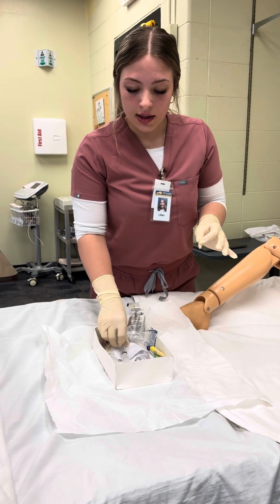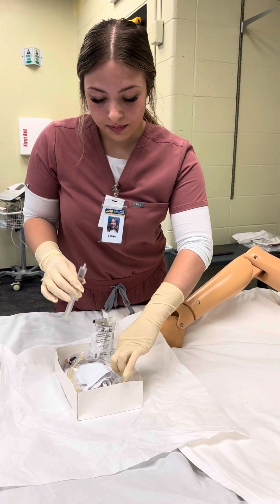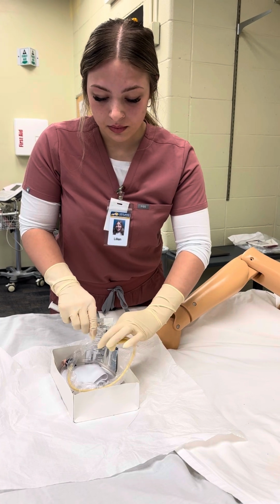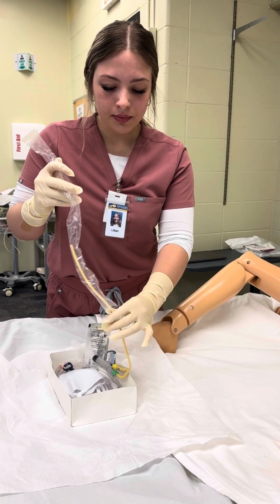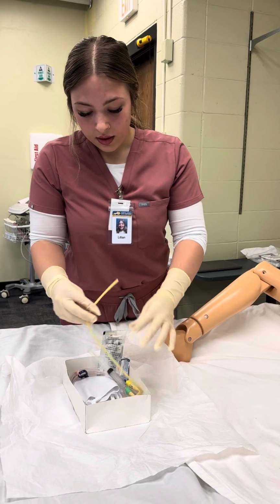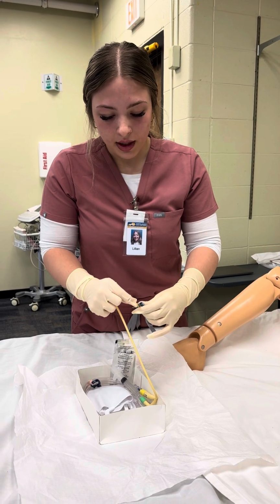Going to go ahead and attach the syringe to my catheter. And take off the plastic of my Foley. So I'm going to go ahead and put the end of my Foley into the lube. Make sure it is lubricated.